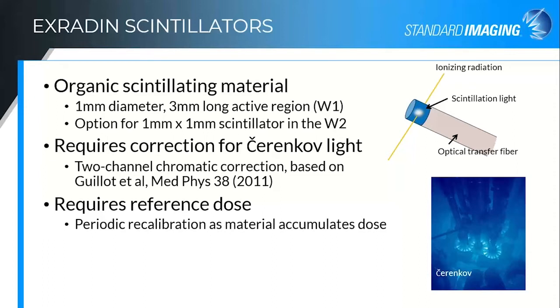The scintillators are not absolute dosimeters. You can't send them in to be calibrated at the calibration lab. These plastics do change color as they accumulate dose, and that changes the way the color is transferred.